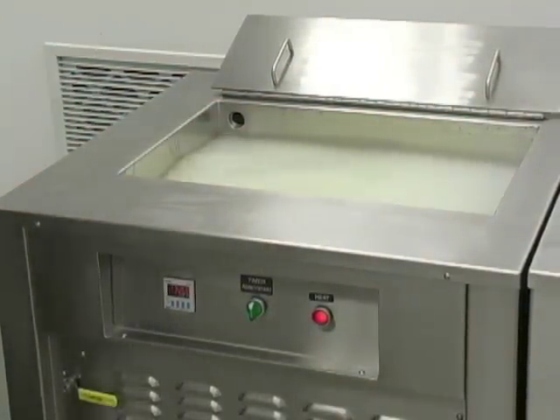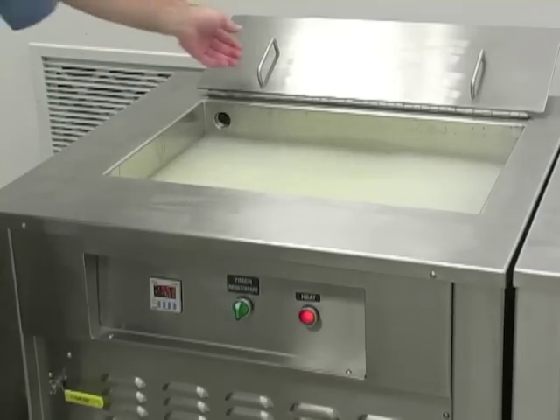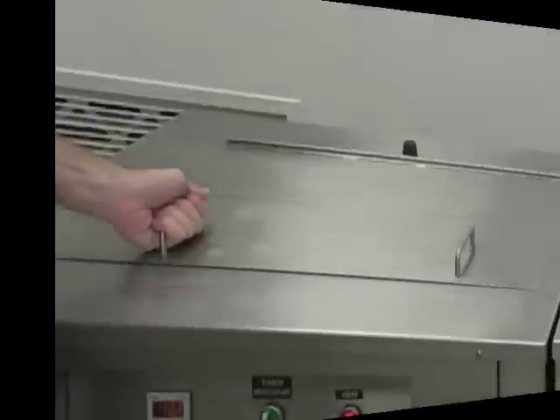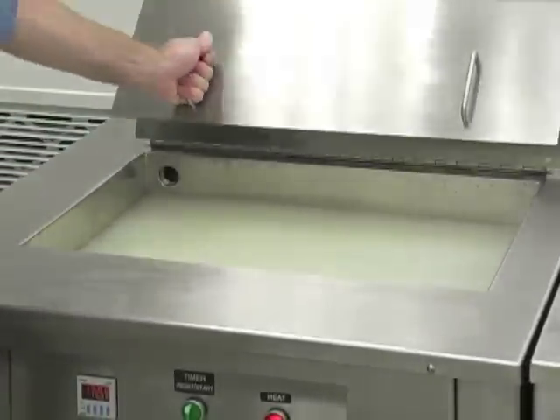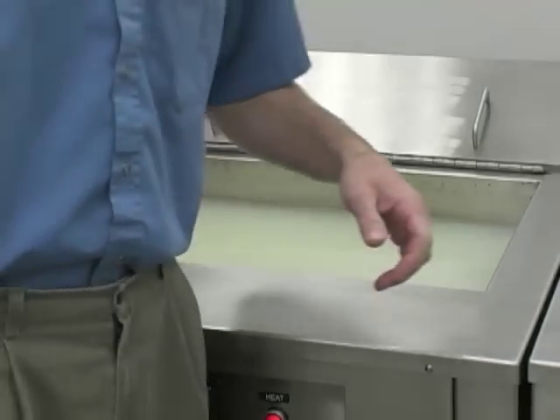Once the unit is properly heated, turn the start button on. Once the unit has stopped, open the lid and walk over to the rinse unit.